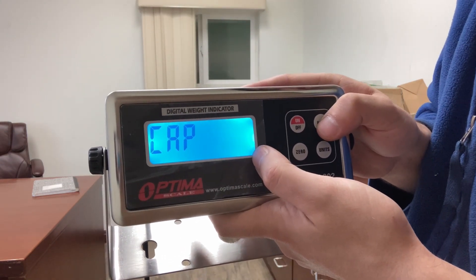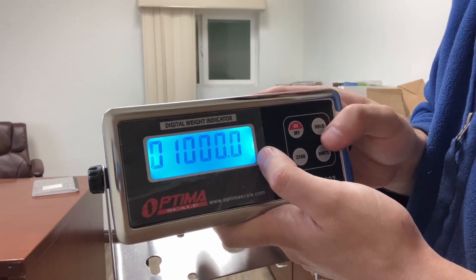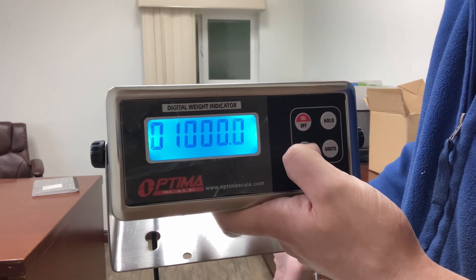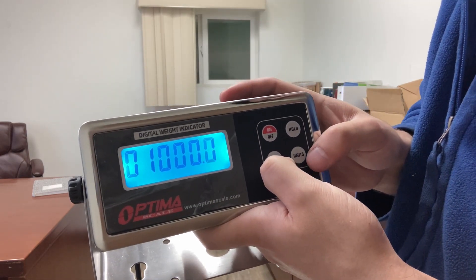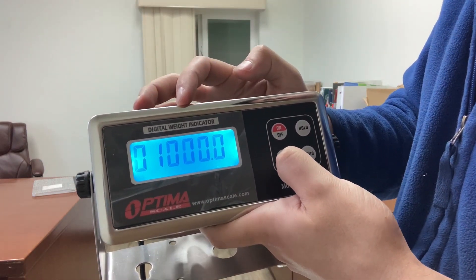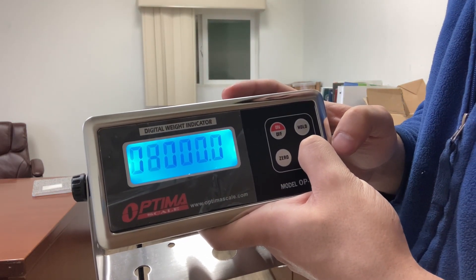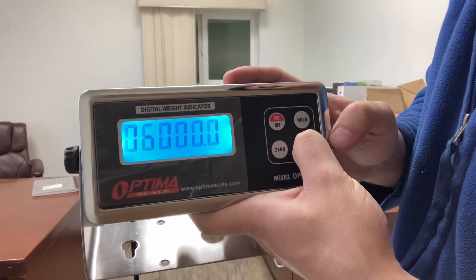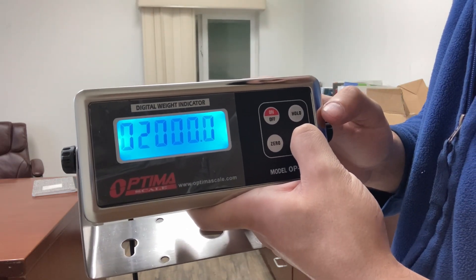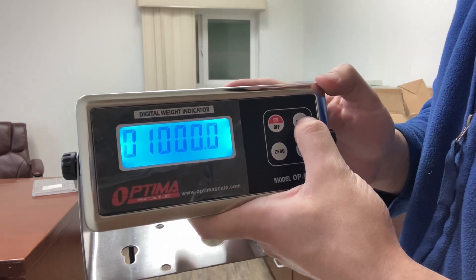Cap is the capacity of your scale. This is where it differs between the non-NTEP floor scale and the VET scale — you'll know the capacity when you buy it. This is 1,000; my VET scale is 1,000 pounds. But if you had a 5,000 pound non-NTEP floor scale, press zero to move left — the flashing number moves left — and decrement by pressing the units button until you see 5,000. If my VET scale is only 1,000 pounds, leave it at 1,000.0. Press hold.